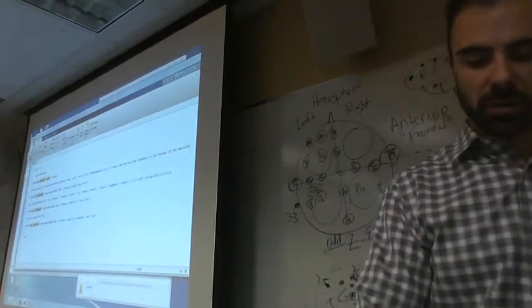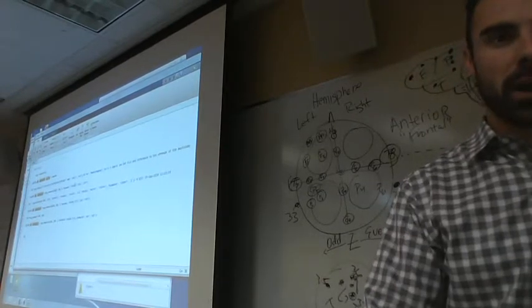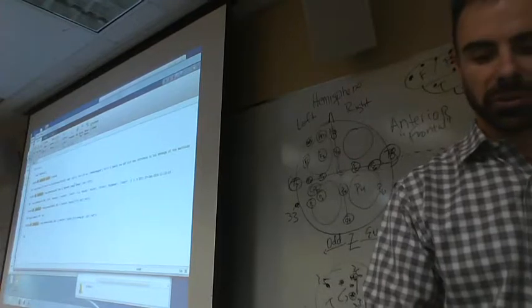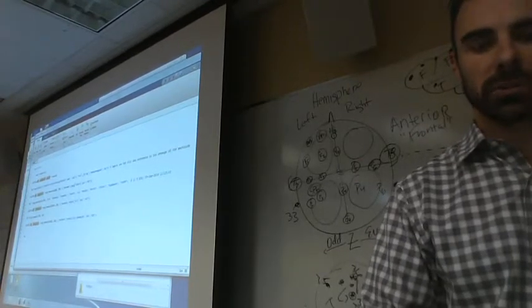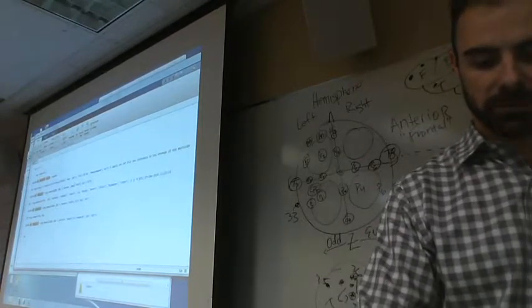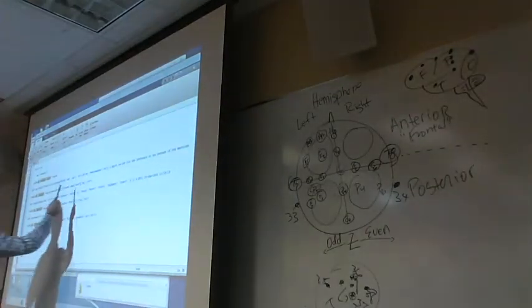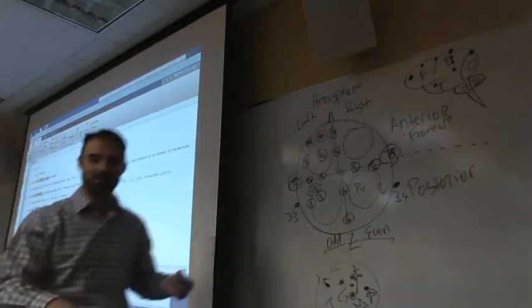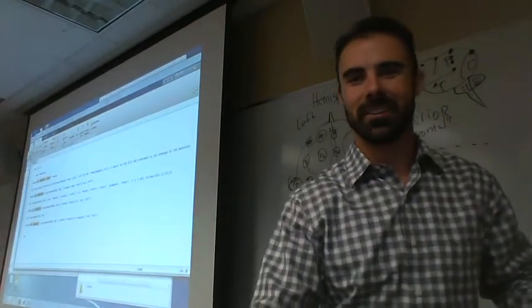All right, so follow along with me here, guys. We're going to start by putting the left open bracket. Then we're going to type the word subj. Then we're going to delete the 4. We're going to close the bracket behind the re-ref. Bam. Job done for this line. Is that a closed bracket after subj? No, I think that's my mouse cursor. I should move that. There you go. Yes, ma'am.